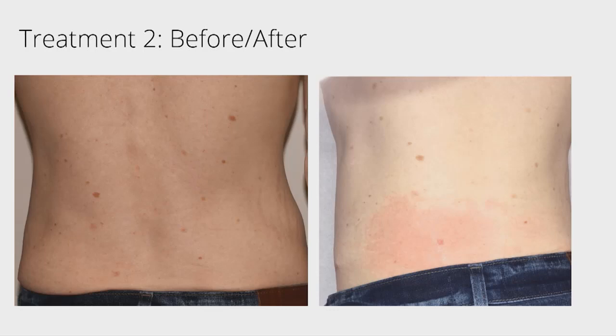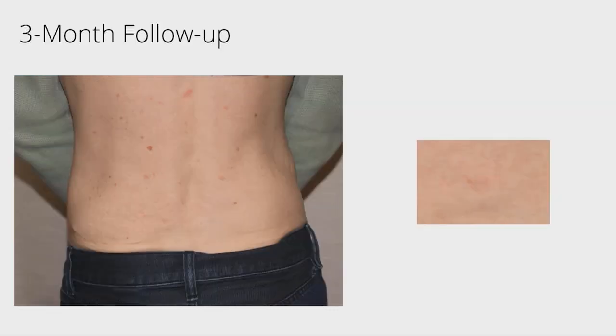And then we did a 3-month follow-up visit to check for persistence of the tumor as well as cosmetic effects. And you can see there is a small scar left behind by this method. Not sure if you're able to point to it, but you may not. No, I'm not. But there was a small scar left behind.